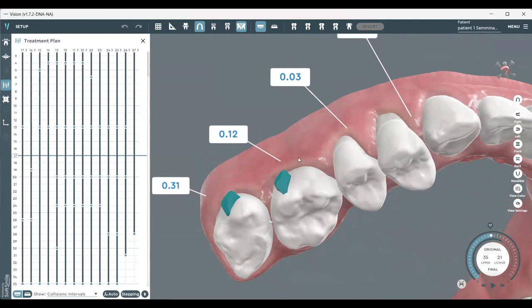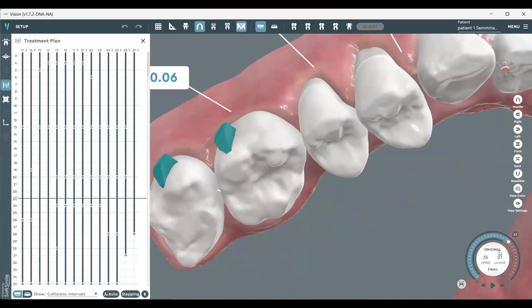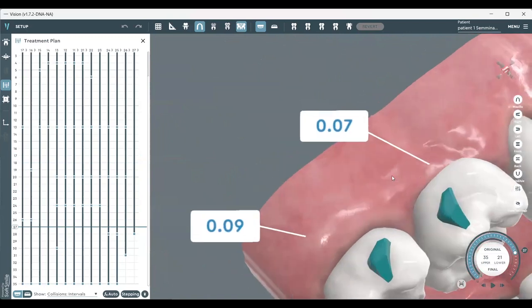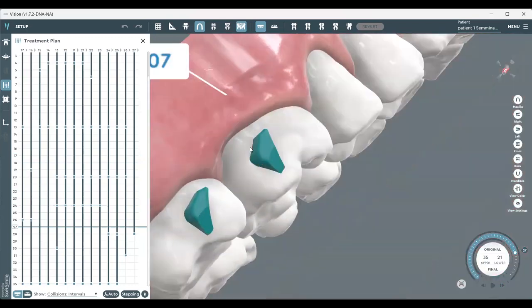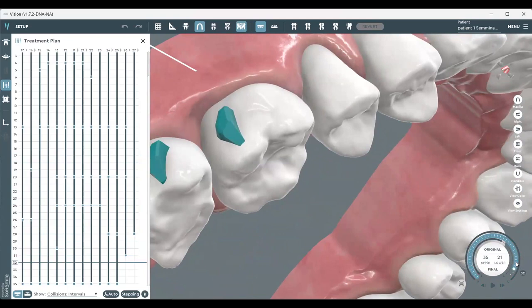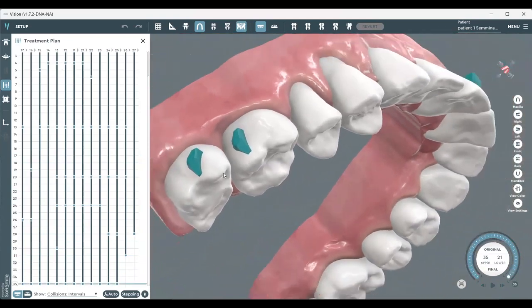That is why attachments are so important, because if we create pressure here, we will need to create pressure also in this part. And then at the moment that the mesial out is done, the attachment can have another active surface to create pressure for the distal in. You can see there. So that is why I use, in these complex cases, multi-plane attachments.